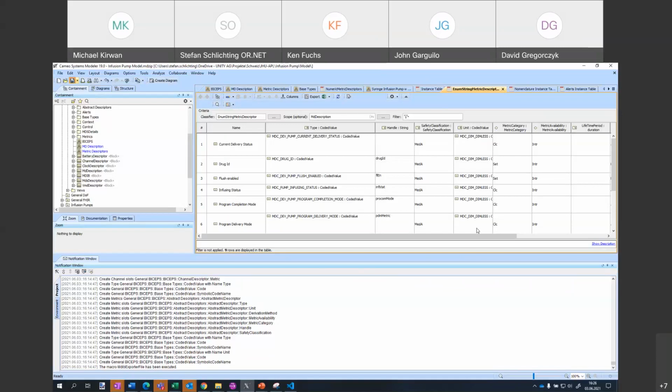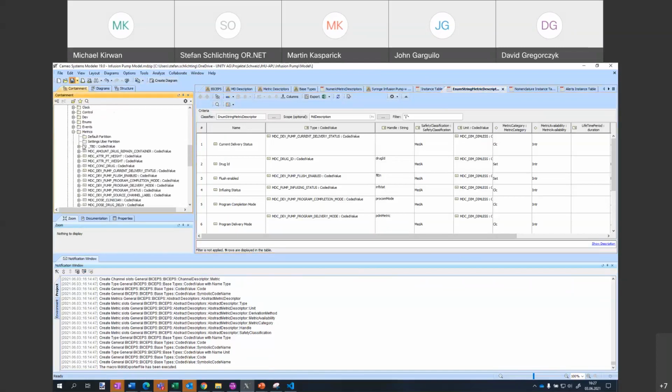So I would like to hook in a question from John some minutes ago. So when I got your answer right, then your model is just an instance. So it's not a dev spec that you modeled, but it's a normal instance of an infusion pump. So for example, we saw just one unit, and we see that nearly all elements are marked with MedA, but I assume that an infusion pump would also be valid having these metrics with MedB or MedC or something like this. Yes. So did I get it right that this is an instance and not a dev spec?